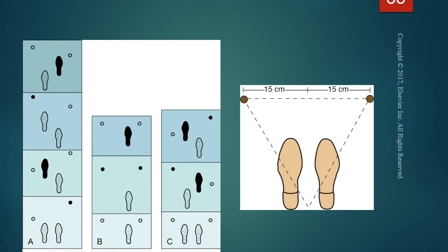Gait with crutches. Patients assume a crutch gait by alternating bearing weight on one or both legs and on the crutches. You want to determine the gait by assessing the patient's physical and functional abilities and disease or injury and the resulting need for the crutches. This photo summarizes the basic crutch stance and the four standard crutch gaits, of which we will practice in the lab.